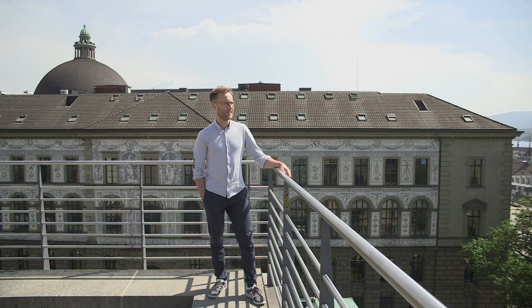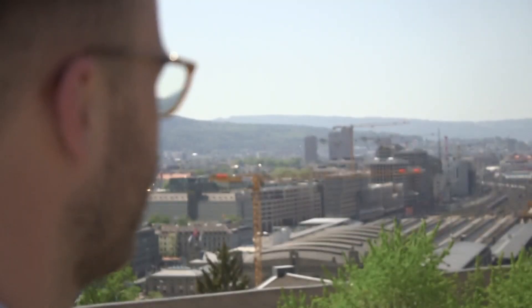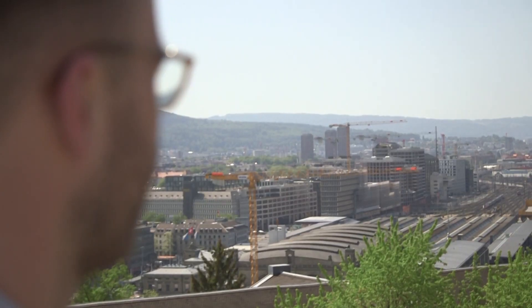To counteract those drawbacks, we asked ourselves: is it possible to 3D print an entire pump, including the driving and bearing magnets? I'm Kai von Petersdorf, and I'm a researcher in the product development group at ETH Zurich in Switzerland.